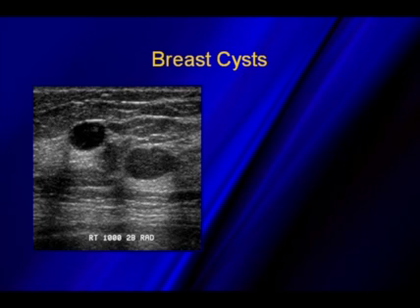And scanning breast cysts, sometimes we'll see things that look like this, where you have one cyst that is almost simple, but if you notice there's a little bit of internal debris. Sitting right next to it is a lesion that almost appears to be solid. Nice through transmission, similar to the other cyst. No matter how we turn the transducer, it remains round.